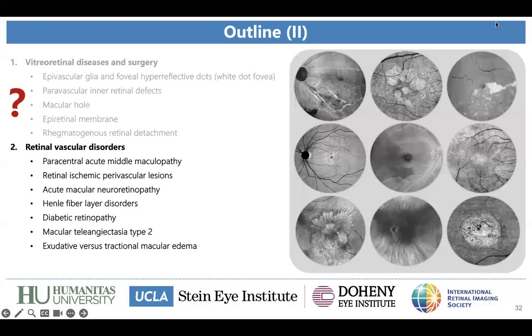And then, of course, also looking at the cross-sectional OCT. So if there are microaneurysms or other lesions like CME or exudates, we can also take a look at the middle retina, so at the deep capillary plexus, that I will show you very soon in the next section. And of course, if the patient complains about metamorphopsia or other symptoms which can be related to the vitreoretinal interface, it's also very useful to use the superficial slab.